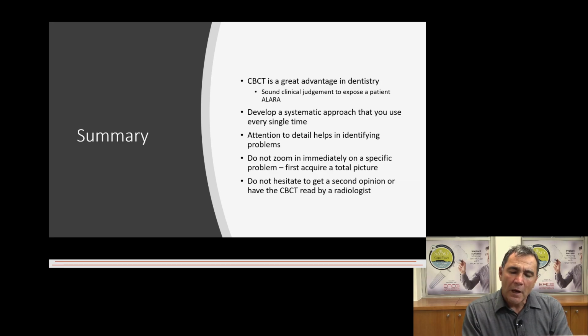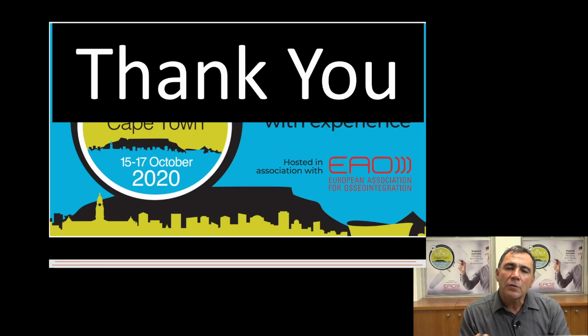And with this, I hope I've given you a little introduction into the intricacies of the CBCT. It's a wonderful tool to be used, but we must use it responsibly.